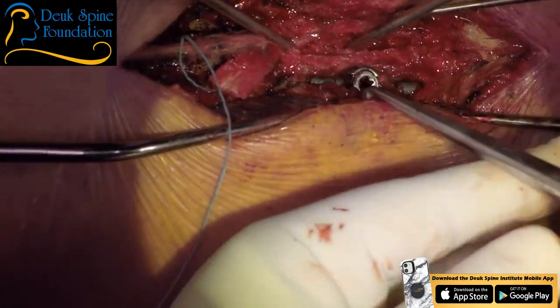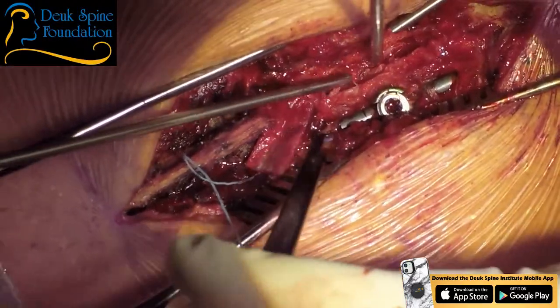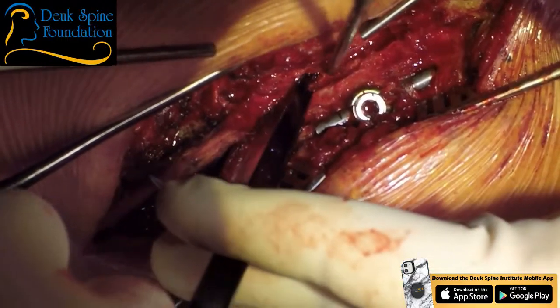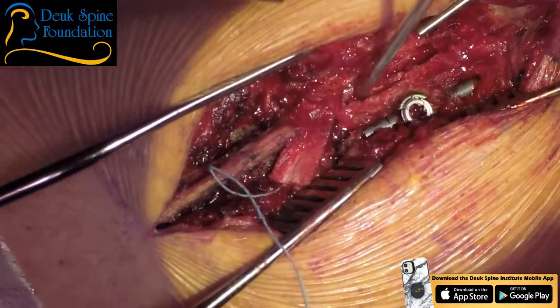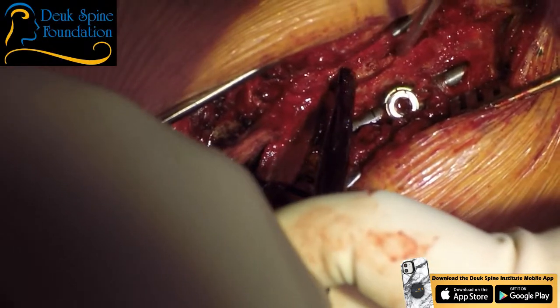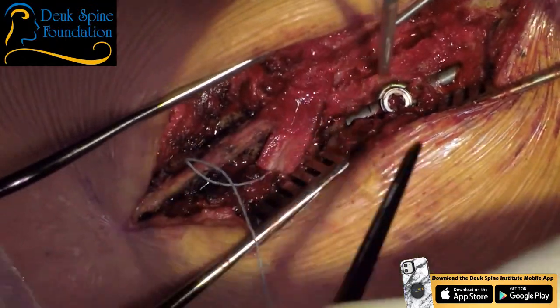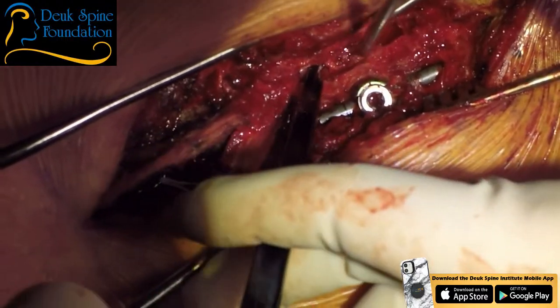Look at that. That's all facet hypertrophy. Kerrison 2. You can see how it's digging in there, right? Patel can see it, but can the audience see it? Probably can. Okay. God, it's terrible. It's so deep. And some of this is rotational deformity, scoliosis, just rotating that facet right into the cord. This is how deformity causes neurological compromise, when you get it. It's not often. But the spine is twisted.